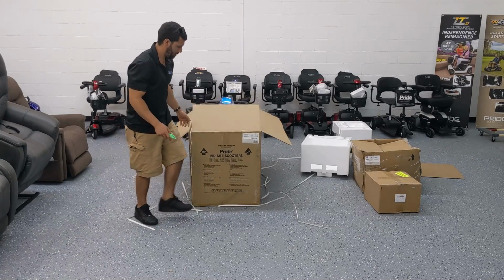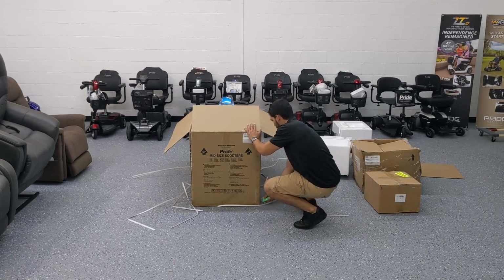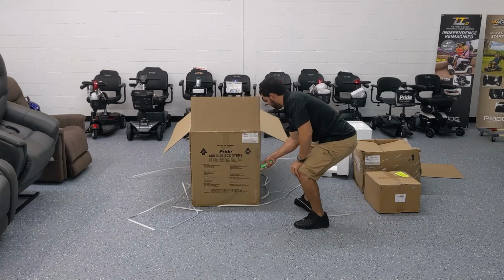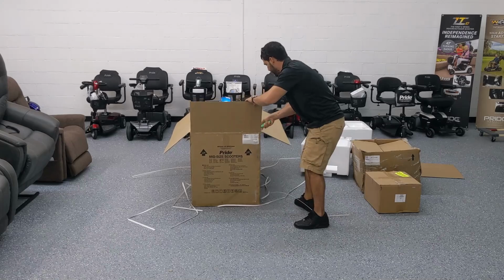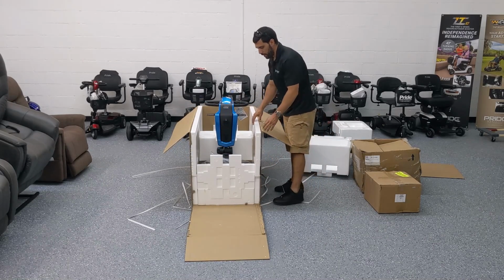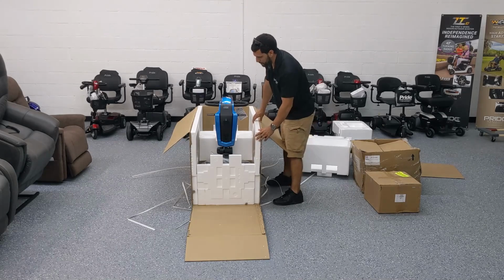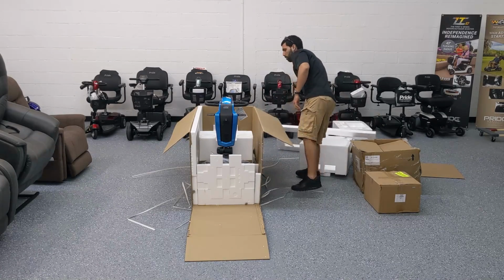Now, if you're not used to using a box cutter or a knife, you may want to have somebody a little bit more familiar with using tools do this for you, because obviously it's a sharp tool and you want to be careful. So I cut the front lip out and laid it flat, just like the box showed you should do. I'm going to start removing the excess styrofoam sides.